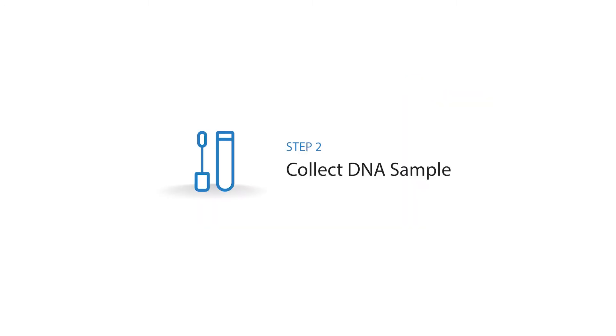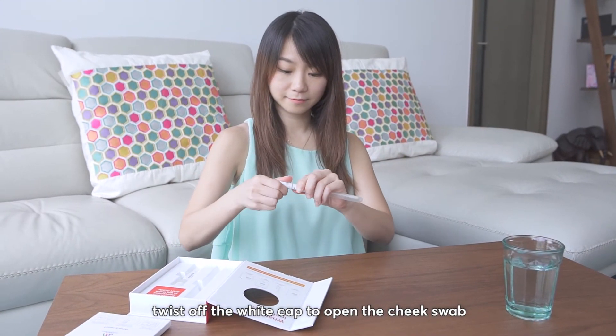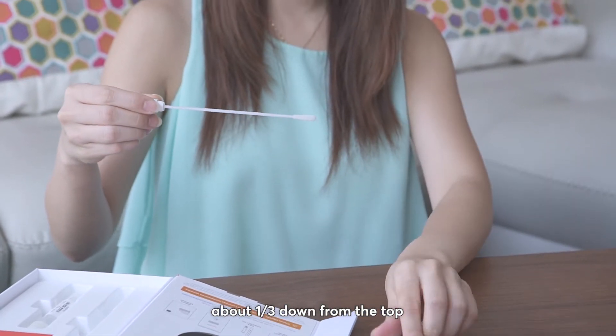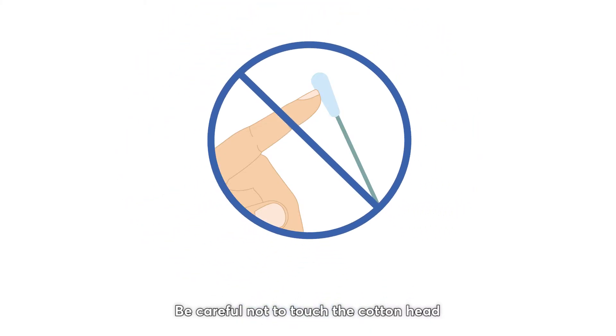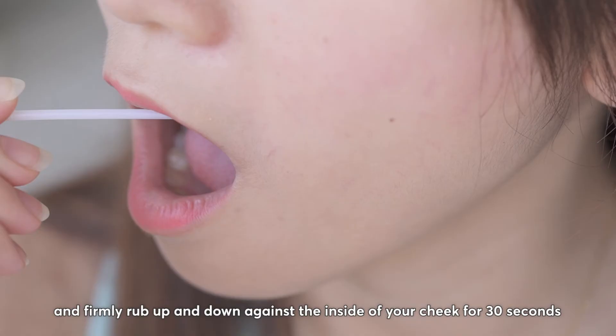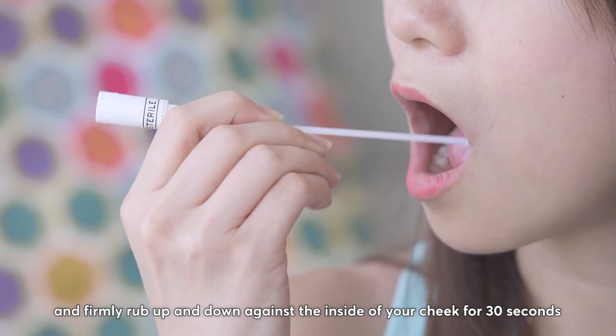Step 2: Collect DNA Sample. With clean hands, twist off the white cap to open the cheek swab. Hold the swab below the white cap about one-third down from the top. Be careful not to touch the cotton head. Insert the swab into your mouth and firmly rub up and down against the inside of your cheek for 30 seconds.